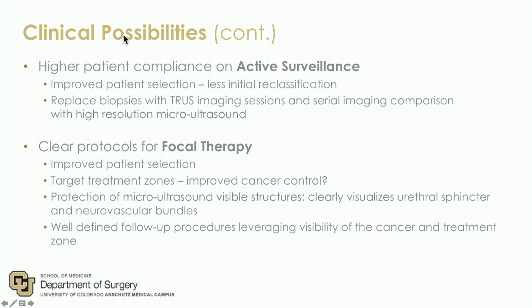Other clinical possibilities: active surveillance, identifying better patients, having better compliance, focal therapy. We've been doing this for over a decade, and it's amazing the interest in focal therapy right now. I call it targeted focal therapy if you do it right and know where the lesions are.